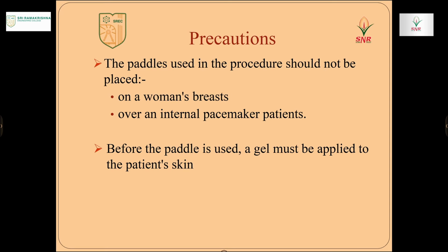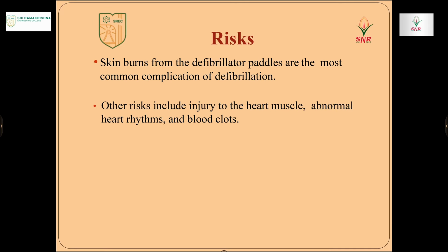So the precautions: the paddles used in this procedure should not be placed on a woman's breast and should not be placed over an internal pacemaker. Before the paddle is used, gel must be applied to the patient's skin, which is very helpful for connectivity. And the risks associated with the defibrillator: skin burns caused by the defibrillator paddles are the most common complication that occurs in defibrillation. Other risks include injury to the heart muscle, abnormal heart rhythm and blood clots.